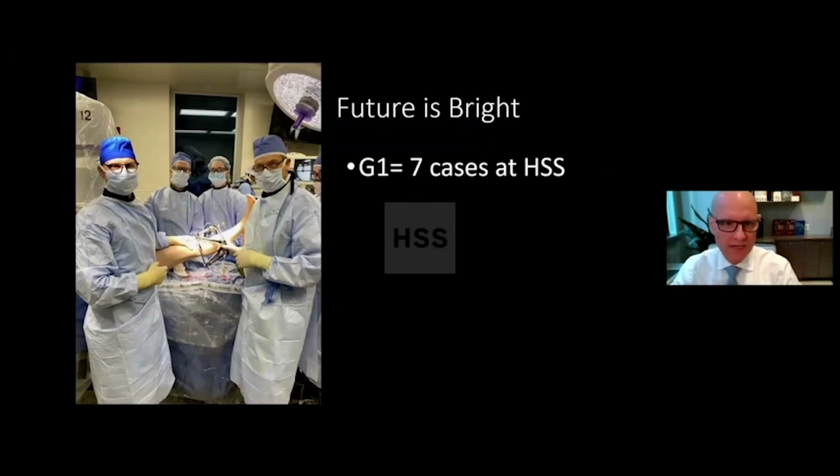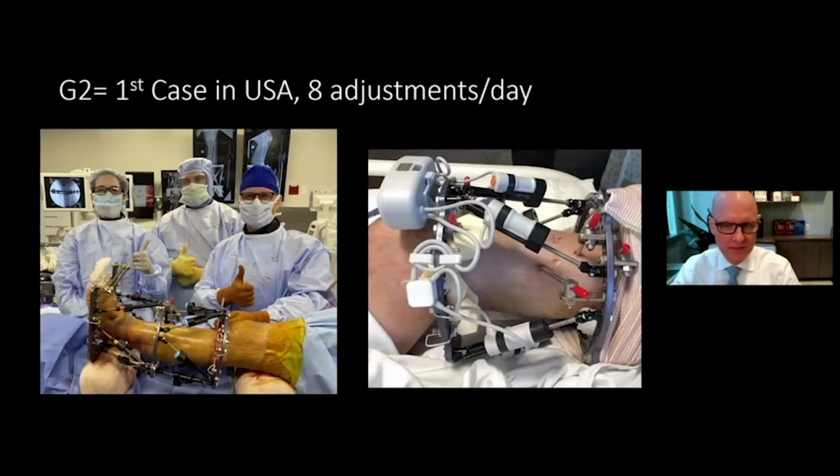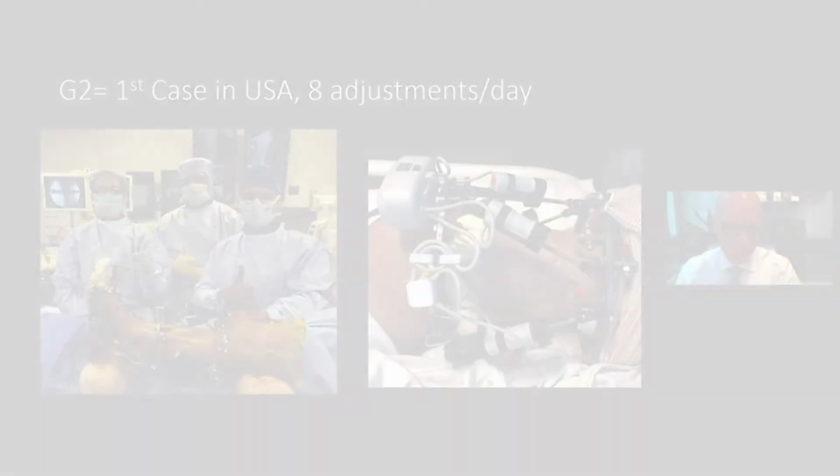The future's bright. We've already done 7 cases at HSS with G1, and then we did our first G2 case this week. And this is easier workflow even. These struts are the exact same sizes as the normal struts for MaxFrame, and then you just clip these little motor battery packs in, and they're extremely light compared to the other system. It's only one battery pack.